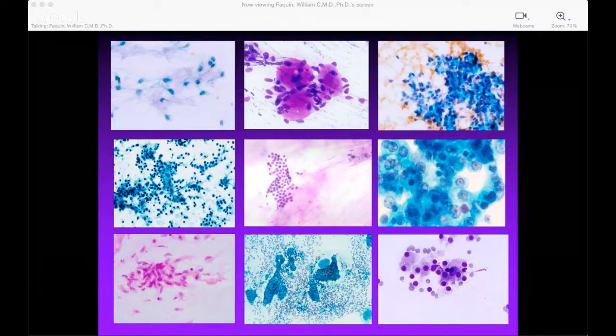And among all of these tumors, there is a lot of overlap. Many of the benign and low-grade cancers can show cytomorphologic and histologic overlap, so they can be difficult to distinguish. There's often overlap between many of the high-grade carcinomas that you can see in the salivary gland.